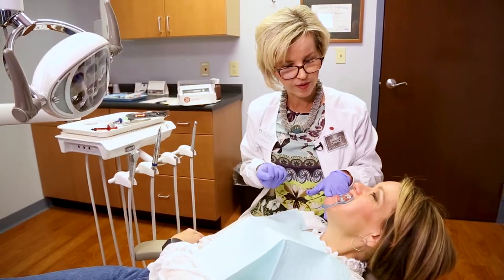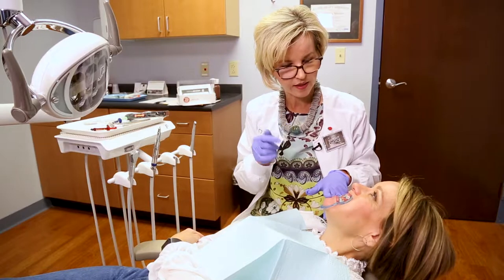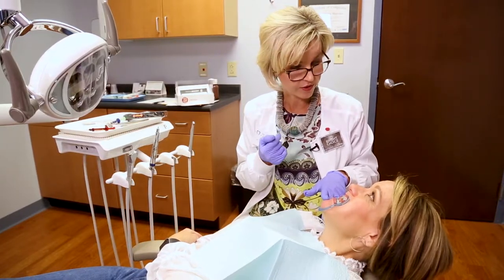We'll just set our timer, and you'll be all set to be rinsed out. We'll take that protective covering off of the gum tissue, and that'll be it for today.